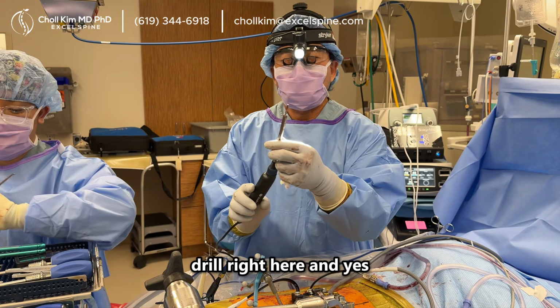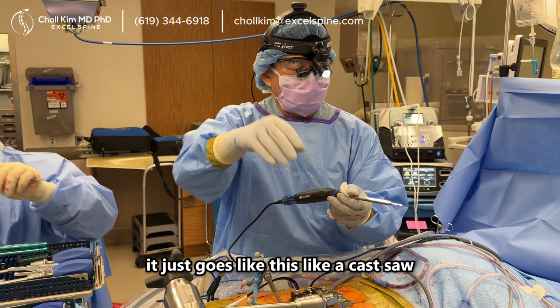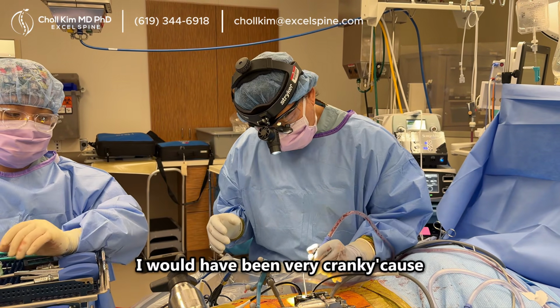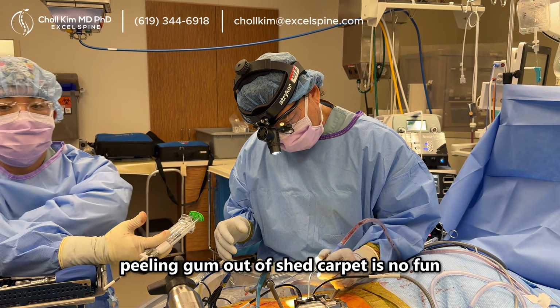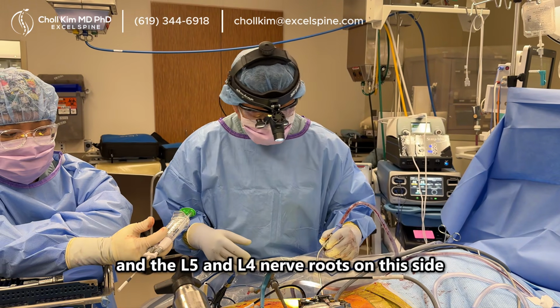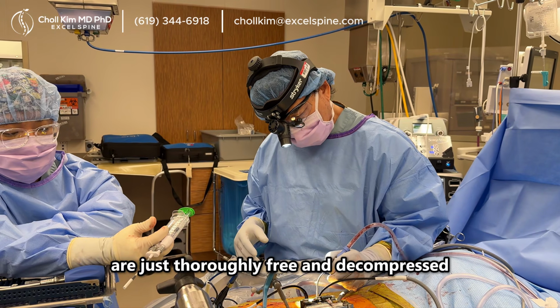And if it wasn't for this drill right here, and yes, it's very, very expensive, it just goes like this, like a cast saw. I was able to take that bone almost right to the dural tube. If I didn't have this, I would have been very cranky, because peeling gum out of shag carpet is no fun. But oh, I feel good. You're taller, you're stable, and the L5 and L4 nerve roots on this side are just thoroughly free and decompressed.